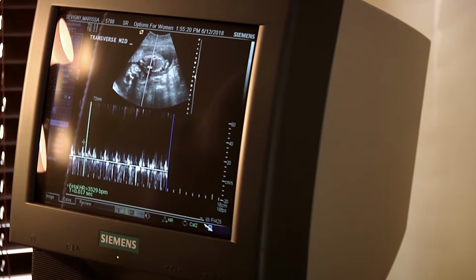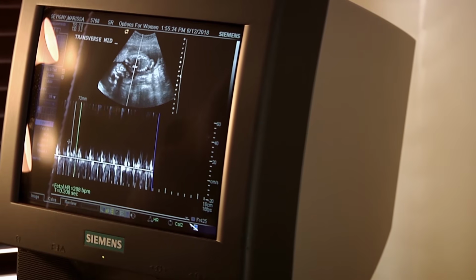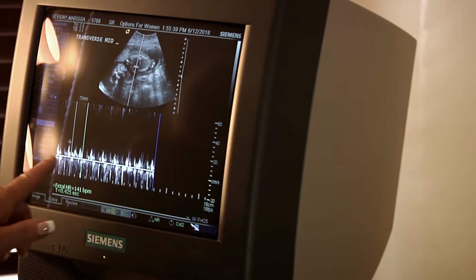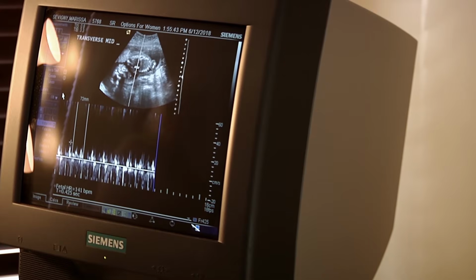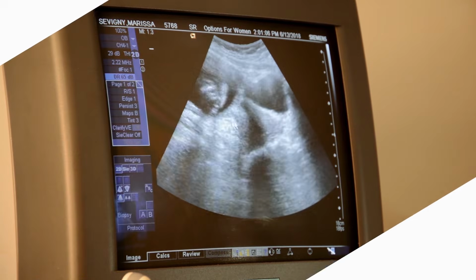That's okay, as long as you're in the same place. I would say right about there, because you started here and then in there. 141.